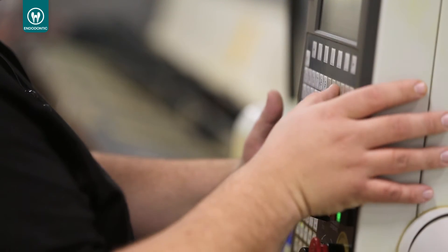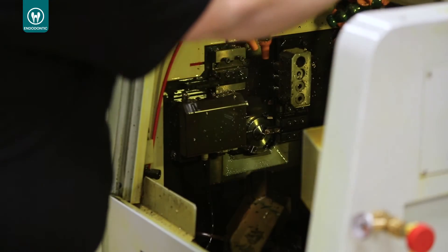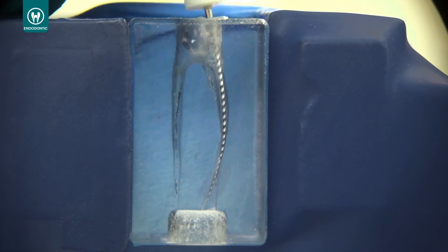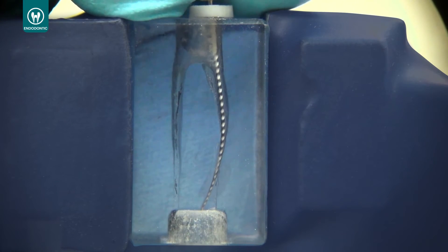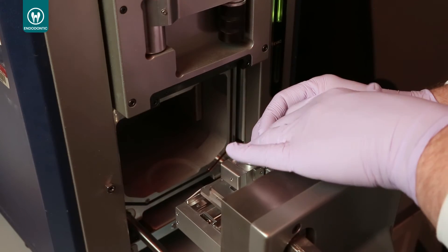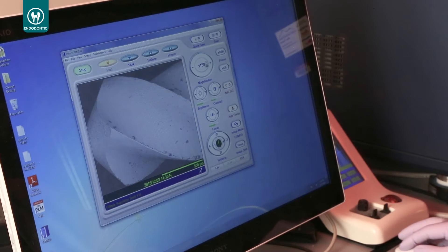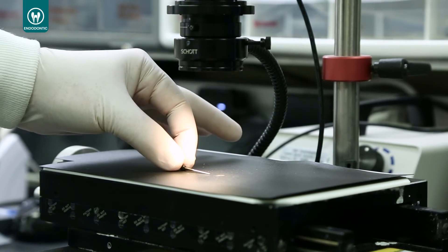The Ultradent Hand Files use high-end technology in the manufacturing process. The highest quality alloy is used to assure the balanced flexibility to negotiate curvatures and the resistance needed to advance in the apical third. Ultradent EndoEase Hand Files are tested to pass the highest quality standards our customers expect from Ultradent products.